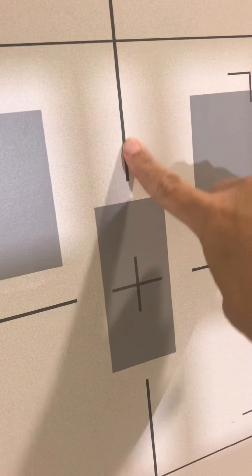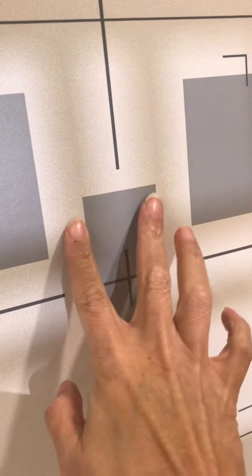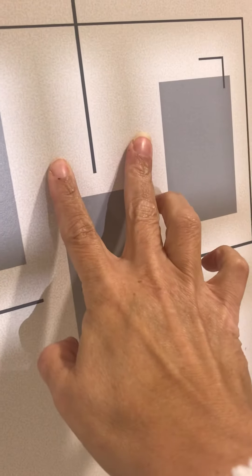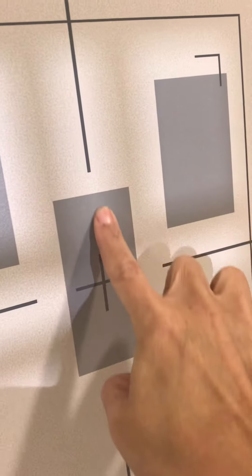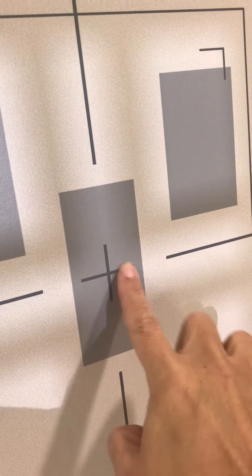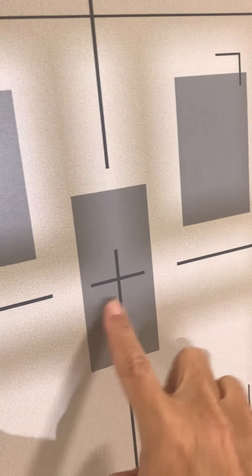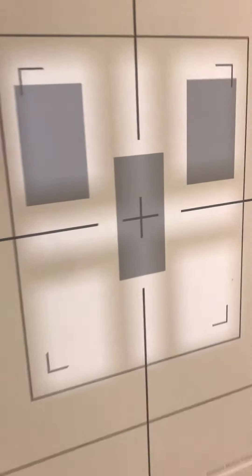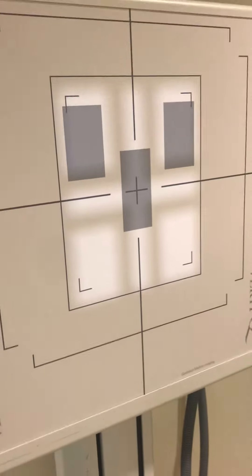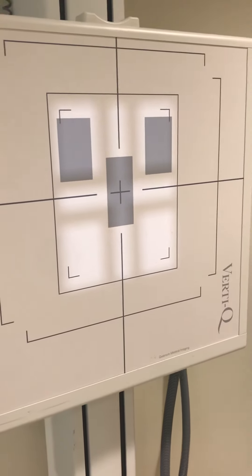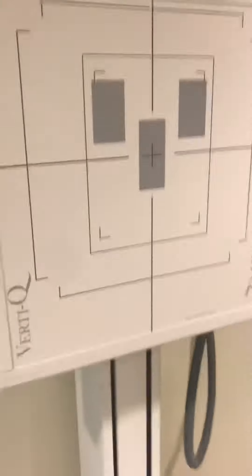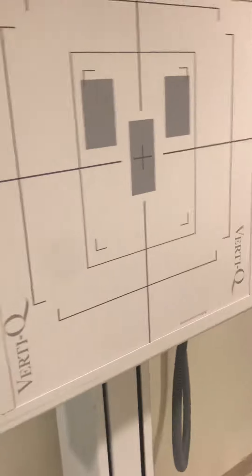I think of these black lines as a car driving down the road — there are the two sides of the road, the car driving down, and the intersection. That's where the center ray is going to be. That's how you work the wall bucky with the x-ray tube.